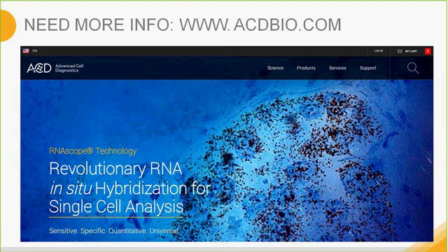One question has come in is for the protease plus, can it be used instead of pretreat 2? The protease plus cannot be used in lieu of pretreat 2. Pretreat 2 is our target retrieval. Protease plus is our protease.